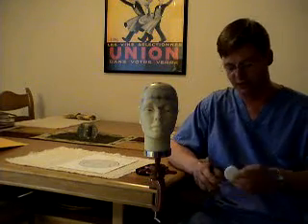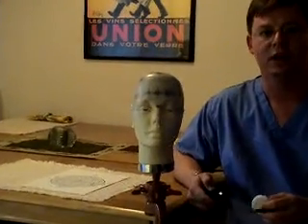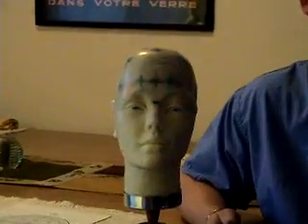Today I'm going to be showing you how to measure and mark a head using only two tools. You need a tape measure and a China marker. It would be nice to start off with a nice clean head, but as you can clearly see, our head today has been used and abused by our staff.